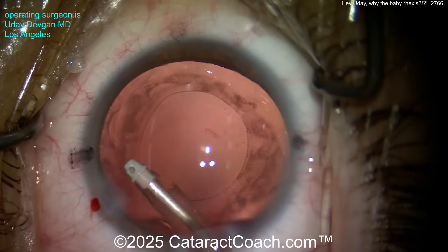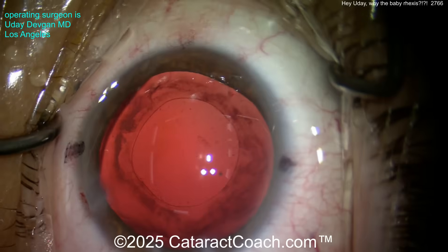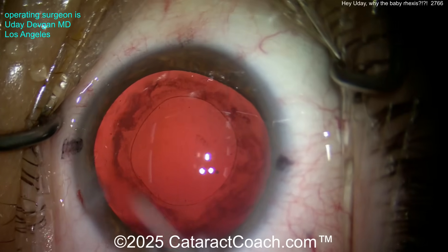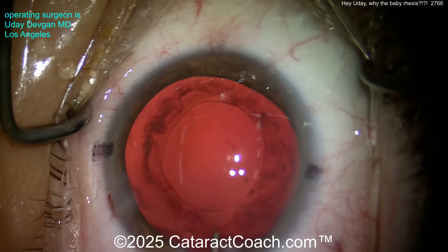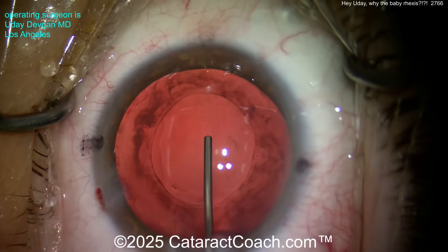That's why I designed those forceps over 20 years ago — with marks on the tip so as you make the rhexis you can actually measure and say, 'hey, this is a correct 5-millimeter rhexis.' In this case we aim for a little bit more, maybe 5.5 millimeters — and we'll find that out.